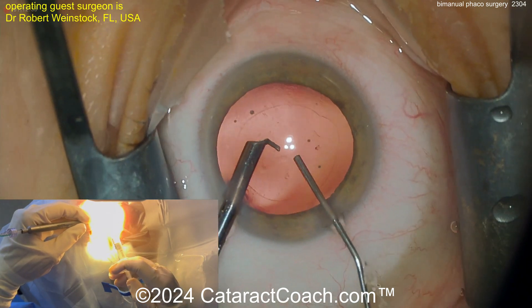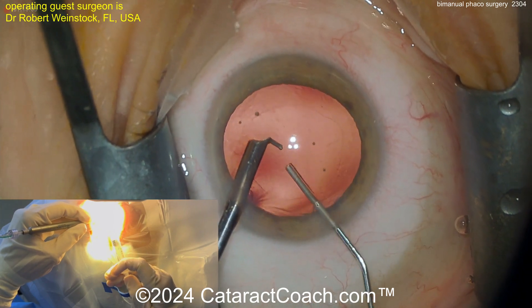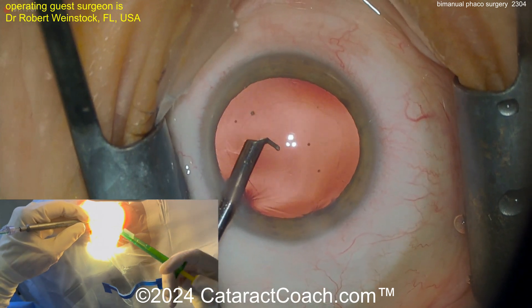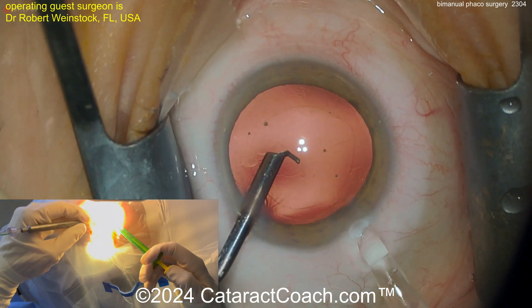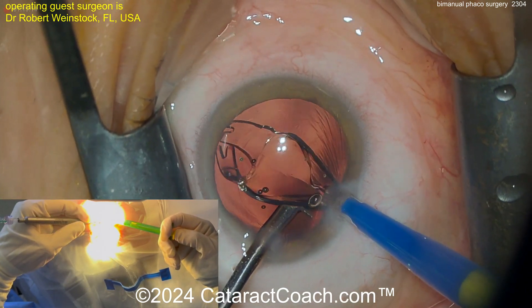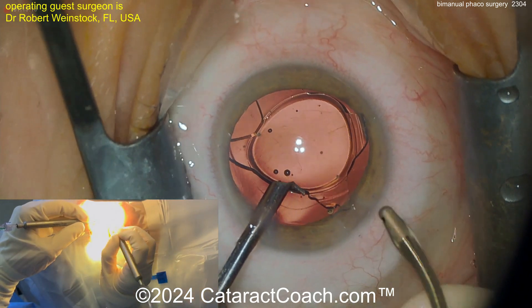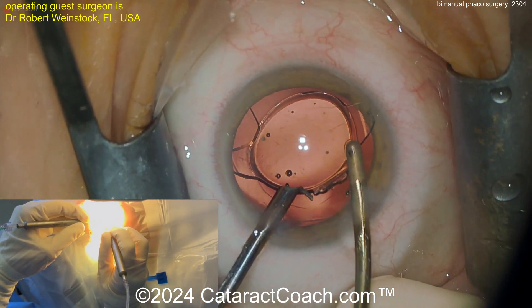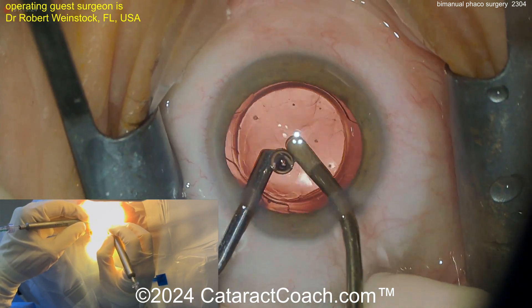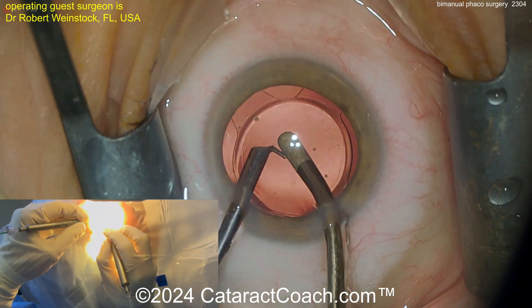At the end of the case, putting in some viscoelastic — probably taking the infusion down to zero as you do that. Take your foot off the infusion pedal and now you can deliver the IOL. Watch carefully — he's not enlarging the incision. He's using a very small Bausch & Lomb lens that goes through a very tiny incision — 1.8 or 2 millimeters. Both incisions are probably just under 2 millimeters in width.